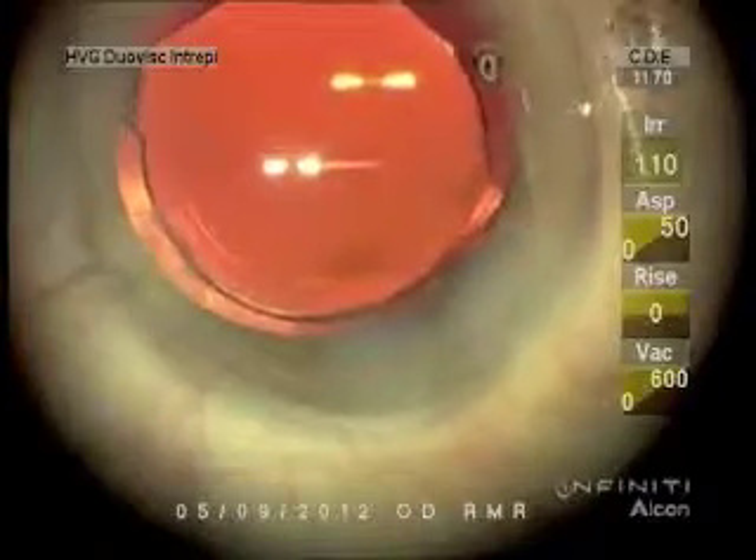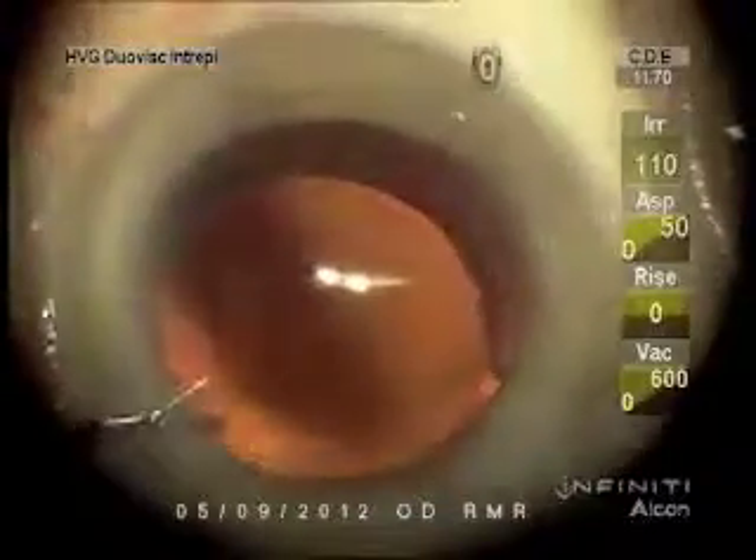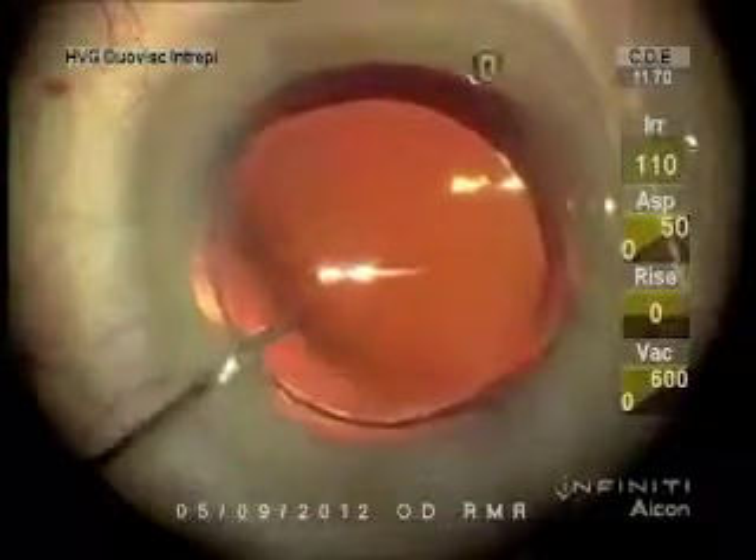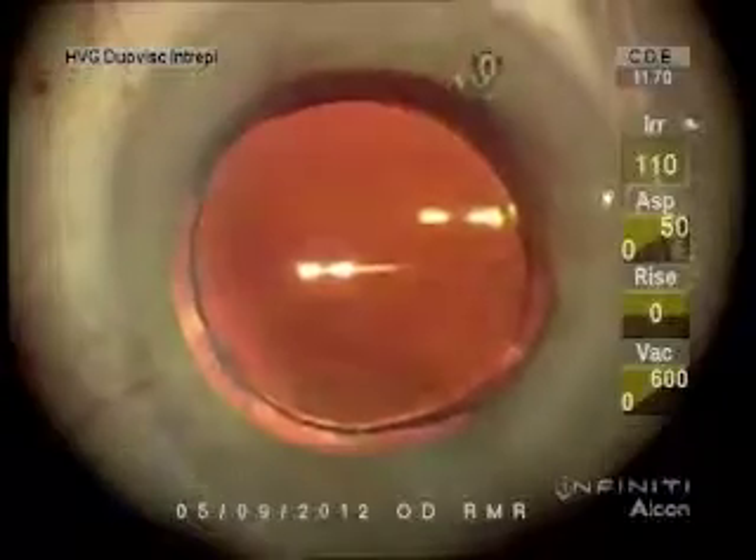Once I know I have sealed incisions, now I'm going to put the vancomycin — one milligram in 0.1 ml concentration — under the lens. I hope it will stay in the chamber longer than I expect it will.